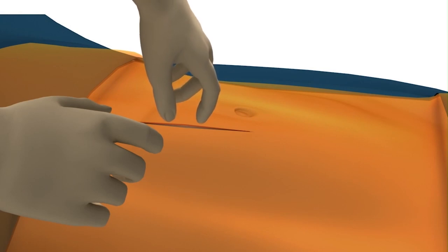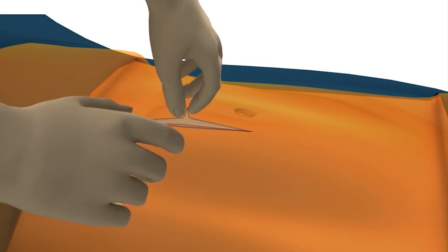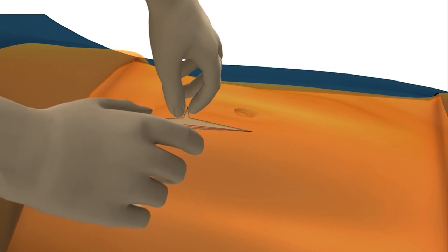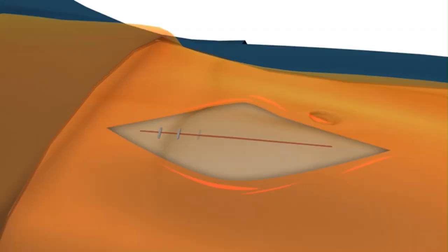To remove the Ioban drape from the incision edges prior to skin closure, pinch the drape film near the edge of the incision to create a crease. Pull up on the crease and gently separate the drape from the skin at the incision edge. Expose up to one inch of skin surface along each side of the incision edge and proceed with closing the incision.